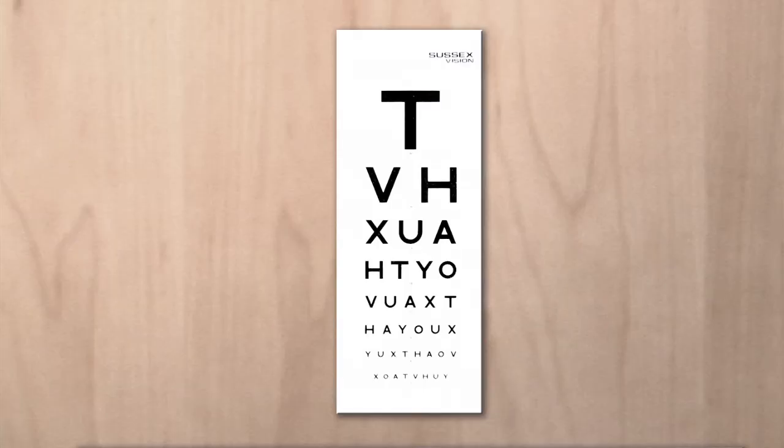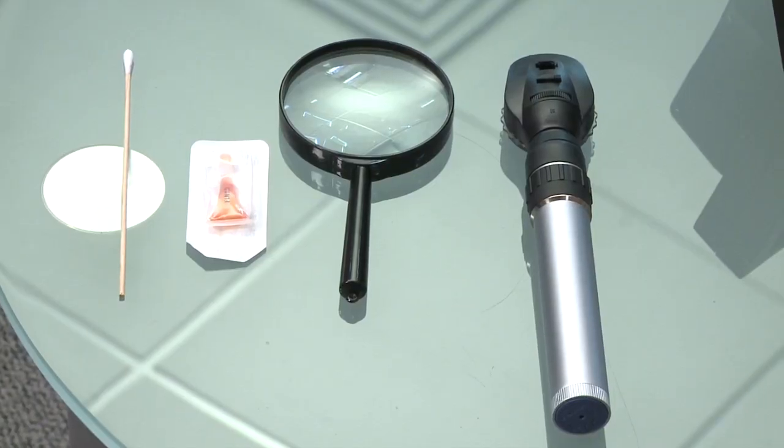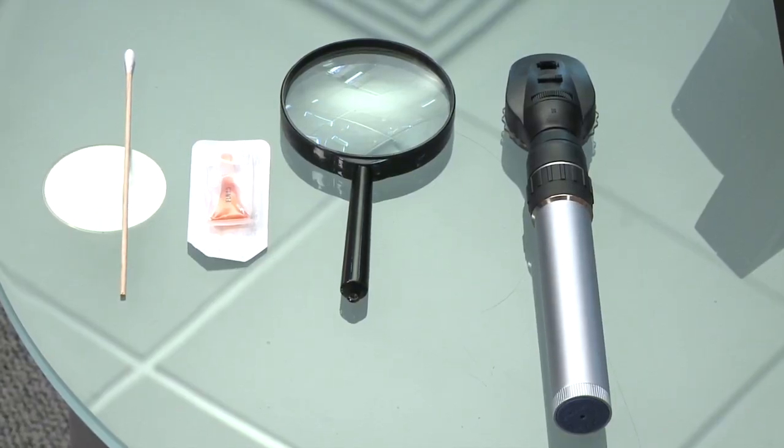We are here to demonstrate a simple eye examination in a GP practice. What you need is very simple equipment: a Snellen chart — shown here is a 3-metre one, a very simple small chart — you just count three steps away and stick it on the wall or somebody can hold it. Ask the patient to wear their glasses, which is what we call the best corrected vision, and test one eye at a time. Other equipment includes an ophthalmoscope, a torch magnifier, fluorescein, and a cotton bud.